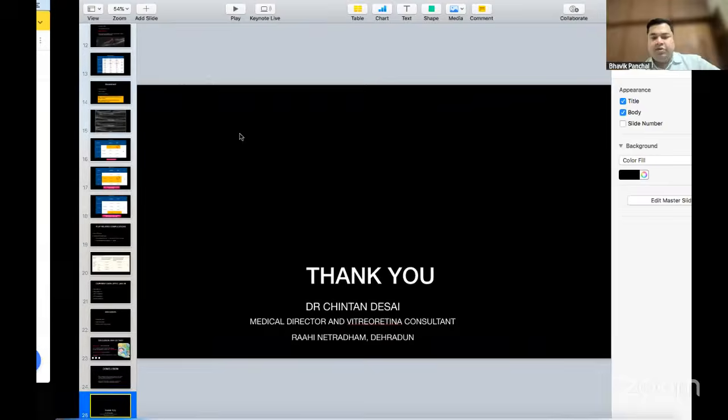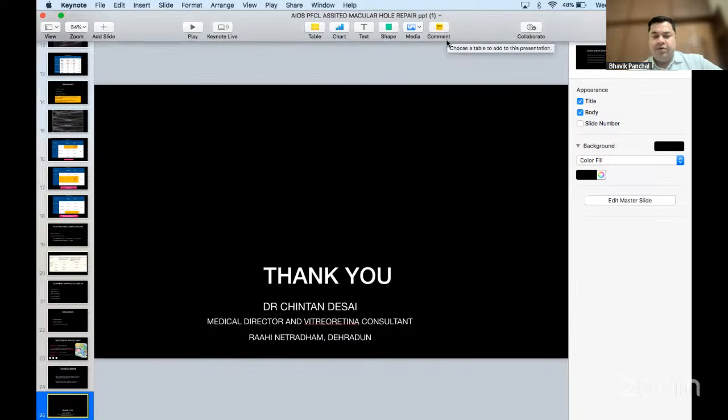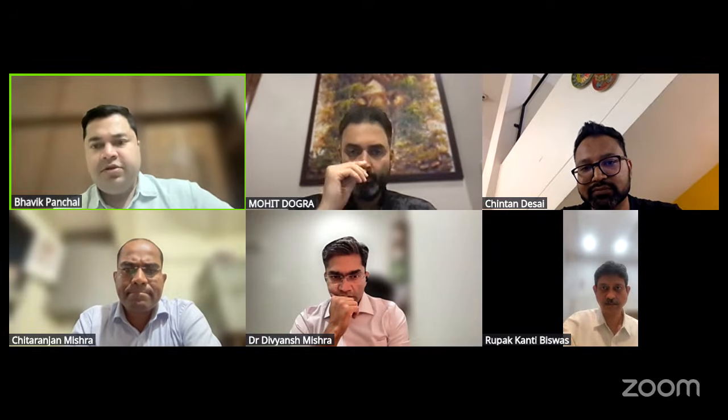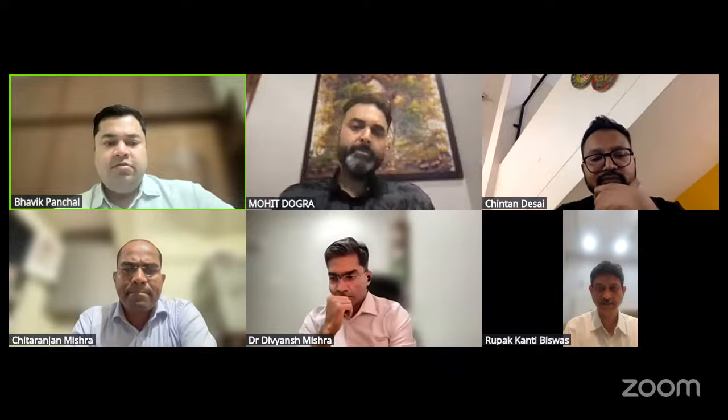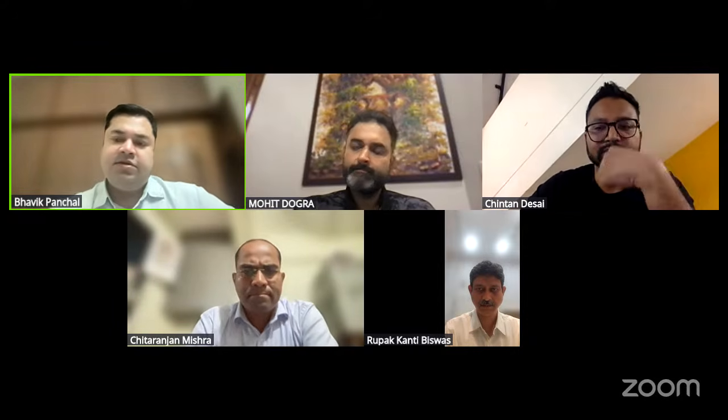Right. Thank you so much, Dr. Desai, for the technique, and I'm happy that you could convert this into a study. I don't know if it's published or not. If not, please do publish it. And yes, we come back to Dr. Mohit about the difference in the techniques and what provides better stability to the flaps. What are your thoughts on PFCL assisted versus a visco assisted technique?